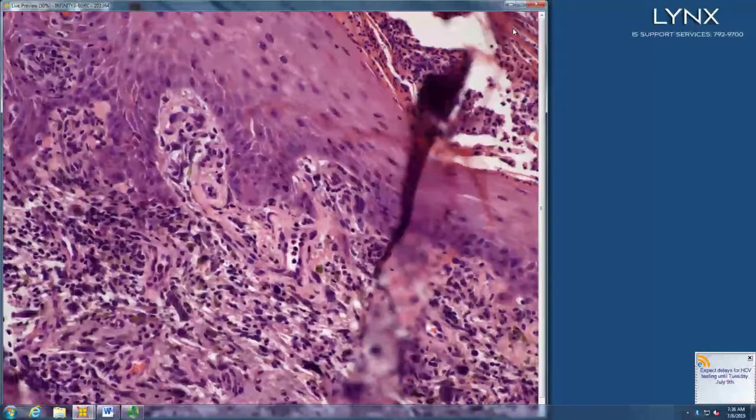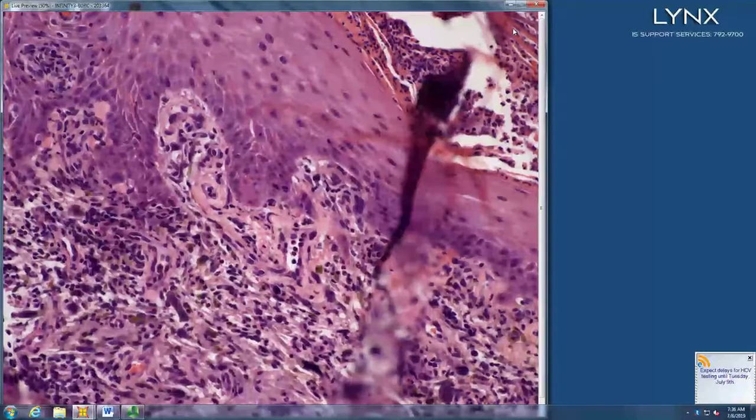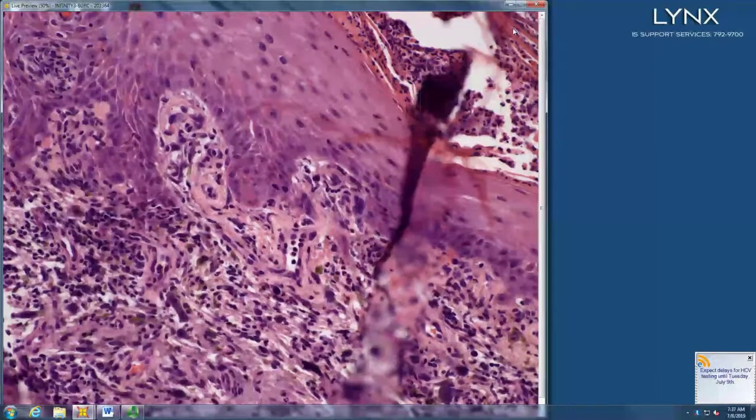Like a pan-keratin or a P63 or an AE1 and 3, and those are negative. An SMA or... SMA is probably too sensitive. We've stopped doing those. So more like desmin or caldesmon these days, and that's negative.